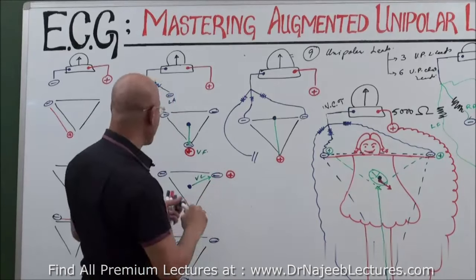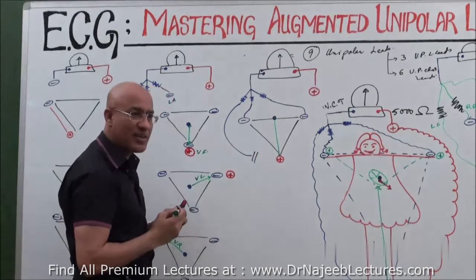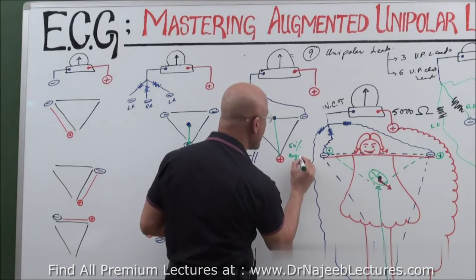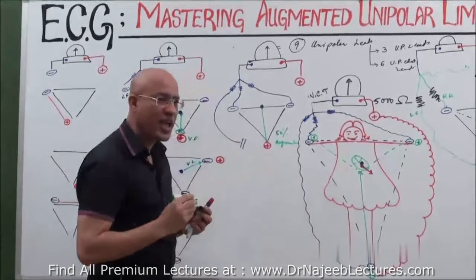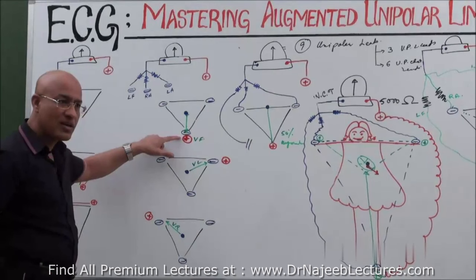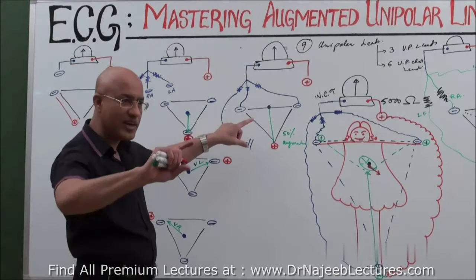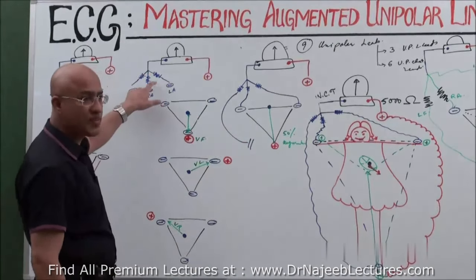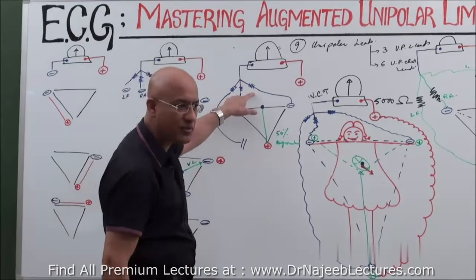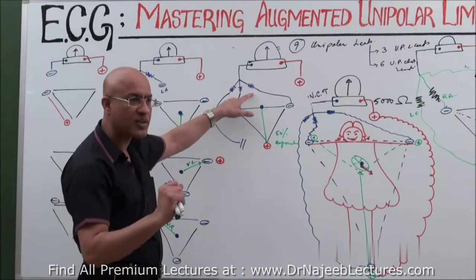But voltage is augmented because previously it was from here up to here. Now it is from here up to that. So voltage was 50% augmented. But because axis of the lead was the same, the ECG pattern was exactly same as by the VF. So in this way, Mr. Goldberger did a trick. He converted Wilson's central terminal into Goldberger's central terminal. He wanted to stamp his name also. Right? Goldberger central terminal.